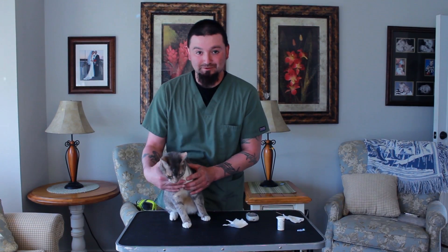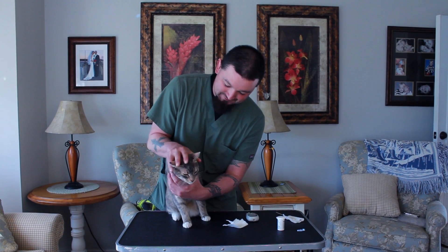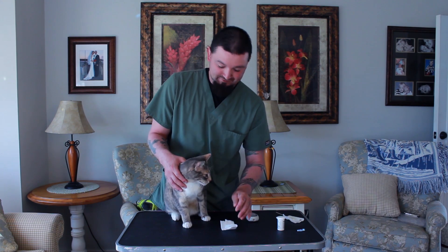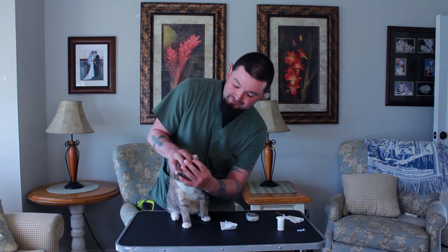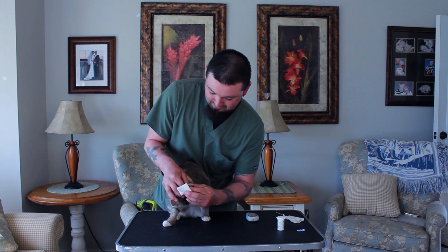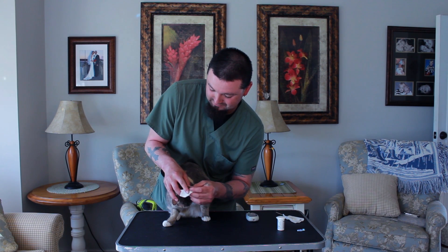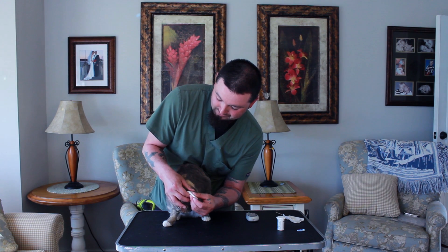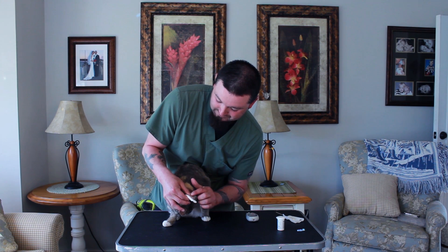Next thing to do is grab a patient and see how they tolerate it. We have Rocky here and we're going to try to get our sample from him. With cats it's a little bit easier to try to get the sample from their ear — you can see their ear veins a lot easier this way. I'll take the cotton ball and put it right behind the ear and slowly apply a little pressure upwards, allowing the vessel to fill with blood.